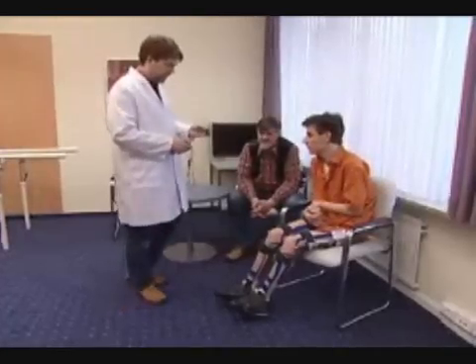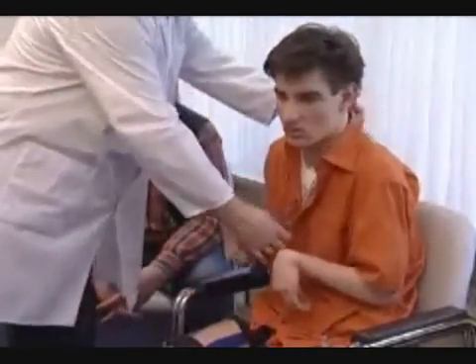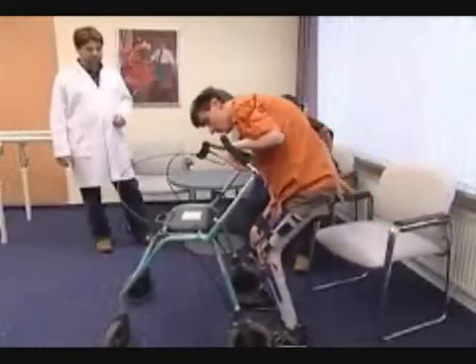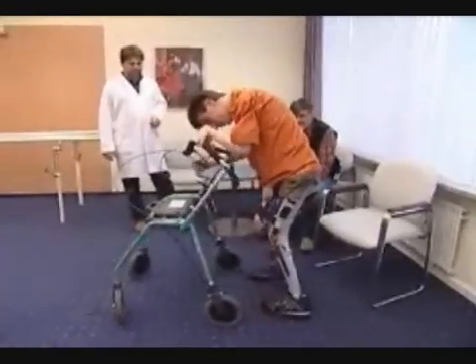Now, the new E-MAG control orthoses provide autonomy for the patient. He can select and influence the function of his orthoses on his own.